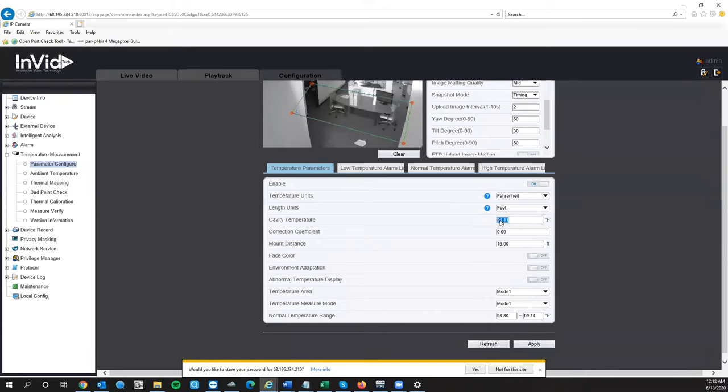Cavity temperature is the temperature your camera itself is running at. Ours is reading 96.11°F. Typically, if the camera temperature gets up to about 95°F or higher, you would turn on Environment Adaption. In most locations the camera fluctuates between 88 and 92°F, but in warmer environments it can run higher. If you're in the 86–93°F range it's not really necessary, but at 94–95°F and up you might want to turn on Environment Adaption — it applies a correction coefficient for more accurate readings.